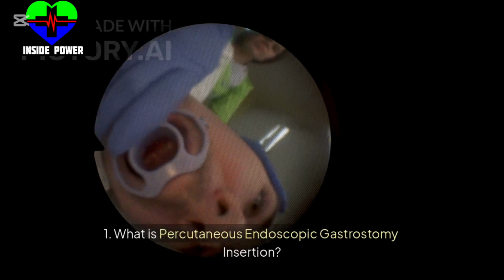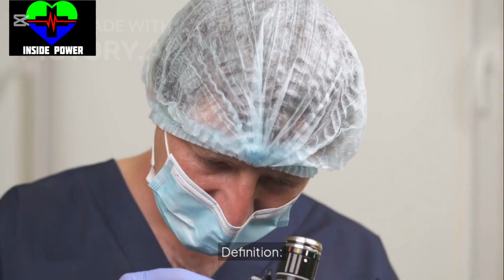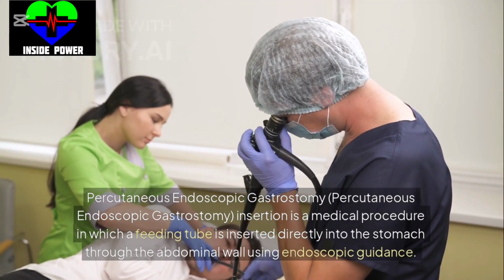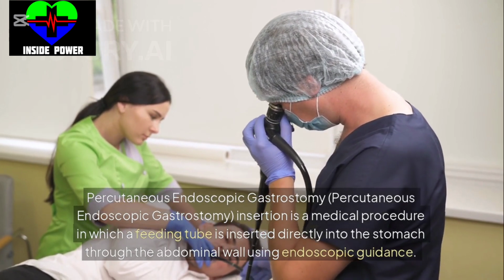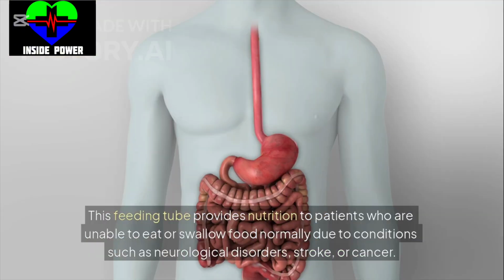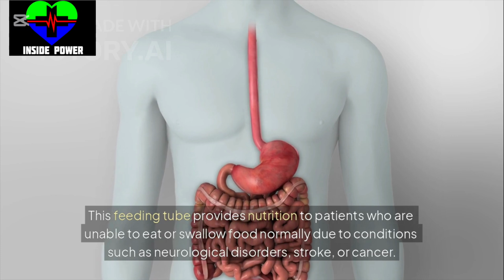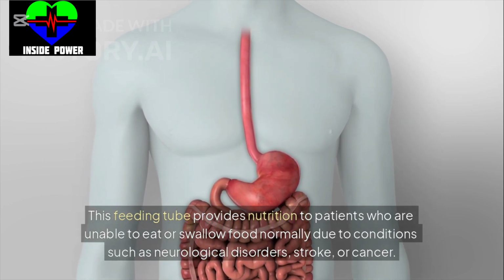1. What is percutaneous endoscopic gastrostomy insertion? Definition. Percutaneous endoscopic gastrostomy insertion is a medical procedure in which a feeding tube is inserted directly into the stomach through the abdominal wall using endoscopic guidance. This feeding tube provides nutrition to patients who are unable to eat or swallow food normally due to conditions such as neurological disorders, stroke, or cancer.